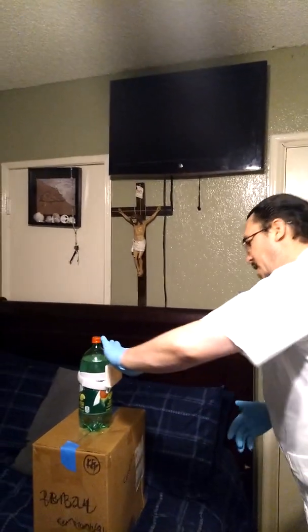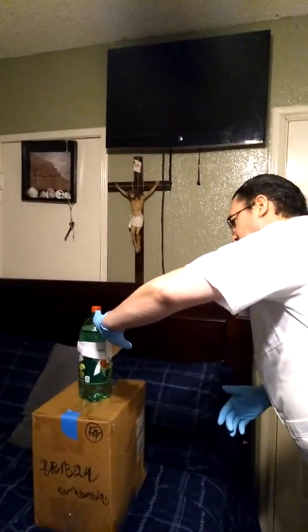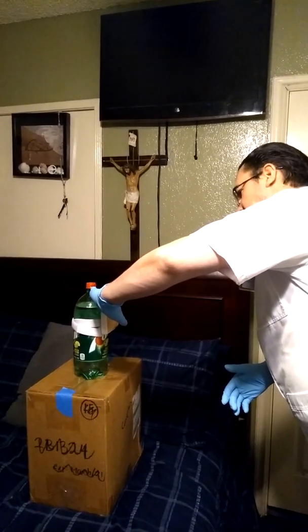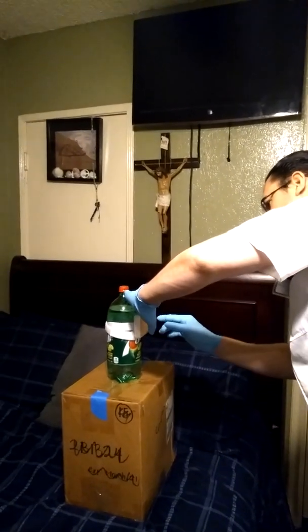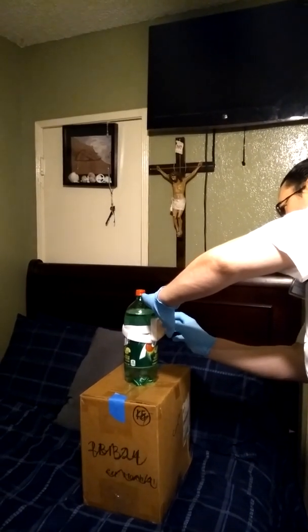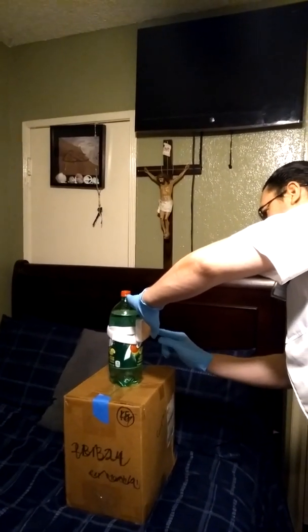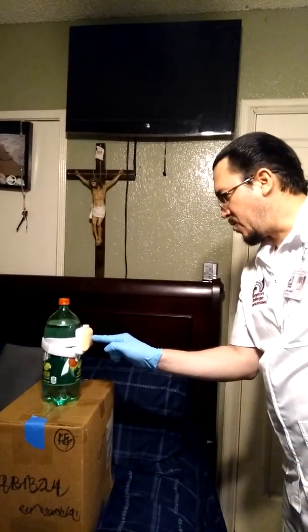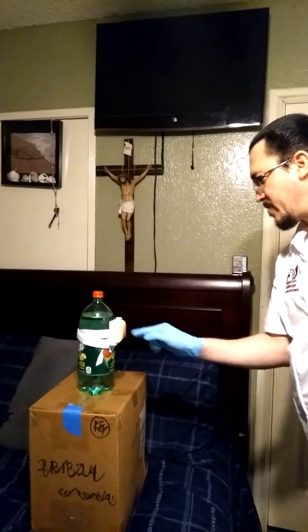The area of the vaccine is 3 fingers below the acromion process, which is the bone in the shoulder. Where I'm gonna inject you is called the deltoid muscle. There's like an imaginary triangle, where I'm gonna inject you right in the middle of the deltoid muscle.